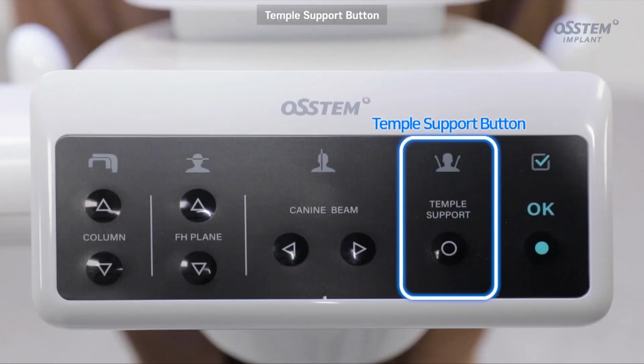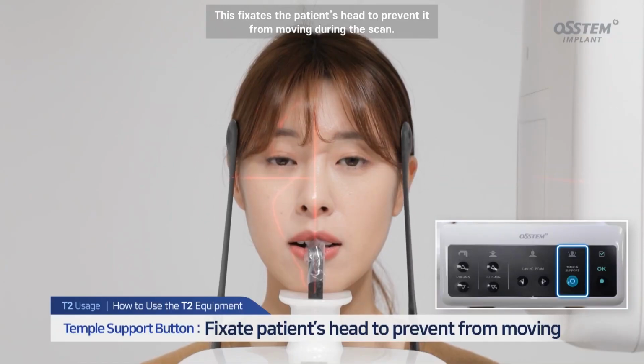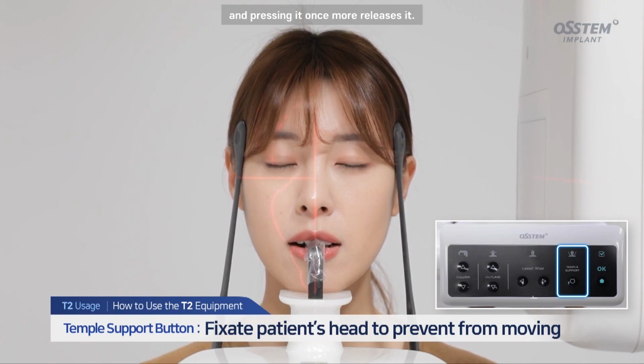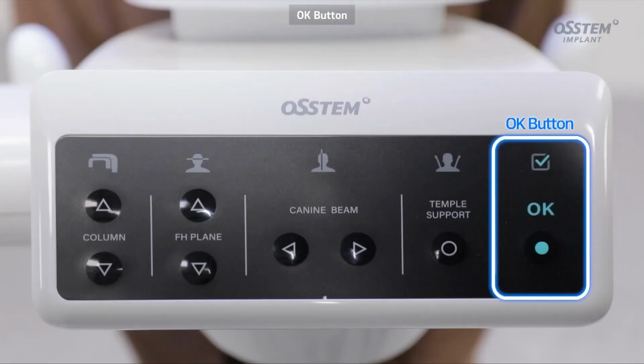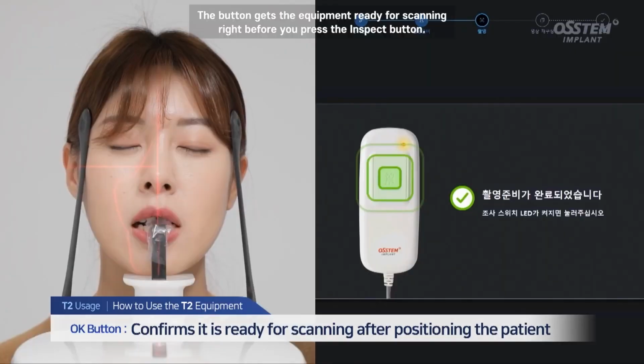Temple support button. This fixates the patient's head to prevent it from moving during the scan. Pressing this button during the panorama or CT scan enables fixation, and pressing it once more releases it. OK button. Once the patient is properly positioned, press the OK button. The button gets the equipment ready for scanning right before you press the inspect button.